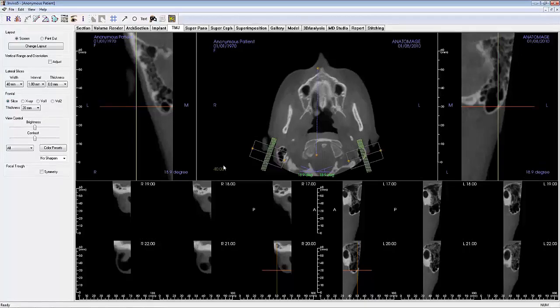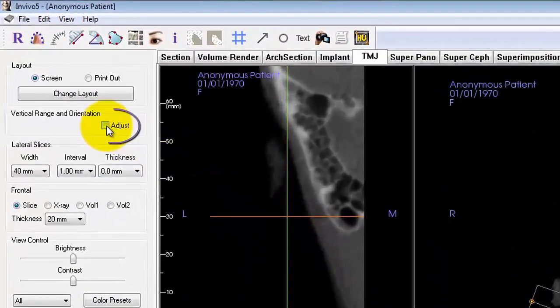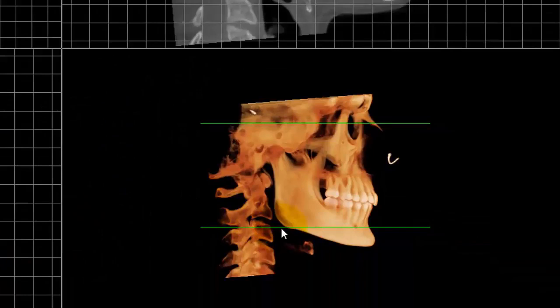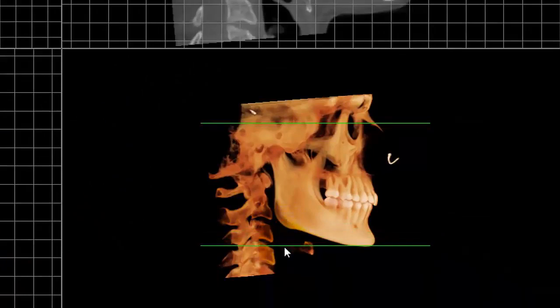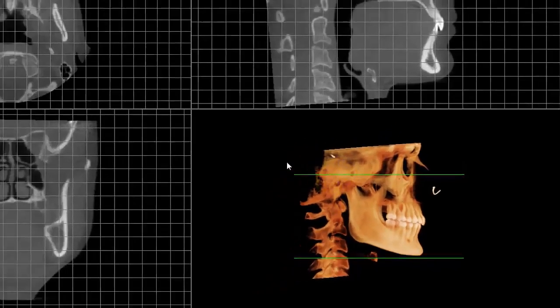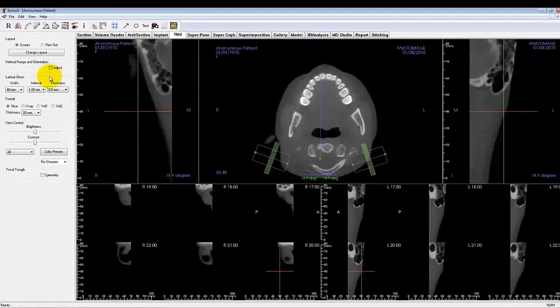First and foremost, the vertical range and orientation should be adjusted. Click on the Adjust checkbox toward the left on the control panel to go to the Adjustment view. On the bottom right of the Adjustment view, you can drag the green bars that set the vertical Z range limits. These should encompass the relevant volume of interest, which in this case would be the patient's mandible. Once you're done, click on the Adjust checkbox again to finish the adjustments.